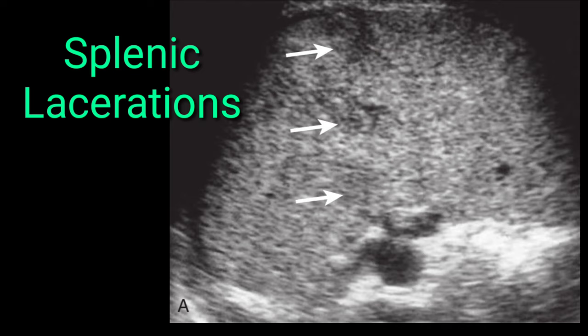Finding laceration on ultrasound imaging is slightly difficult. The white arrow shows splenic laceration — laceration is actually discontinuity of the regularity of the parenchyma of any organ. It appears as hypoechoic areas within the organ's parenchyma. On this splenic image, hypoechoic areas are visible within the splenic parenchyma. The patient was in the emergency department with a history of trauma. Always mention the site and measurement of the laceration on your report.